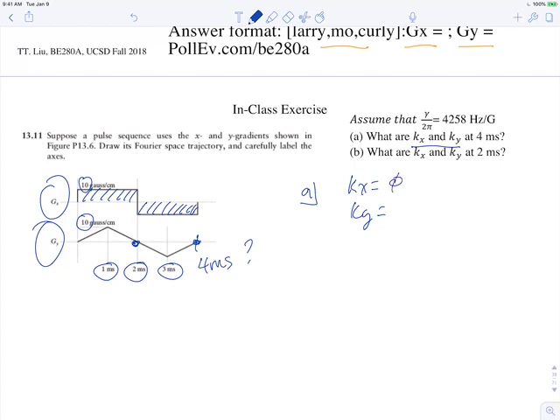This is actually a pulse sequence we'll come back to quite a lot. It's used a lot for different types of imaging. It turns out, even though it doesn't move you in k-space, it actually allows you to image other things. But for now, it doesn't do anything. At the end, we're just back to where we started from in terms of k-space. Similarly, for this one, if I integrate here, it's positive, and then it's balanced out by this negative, and so I'm at ky equals zero. Everyone okay with that?